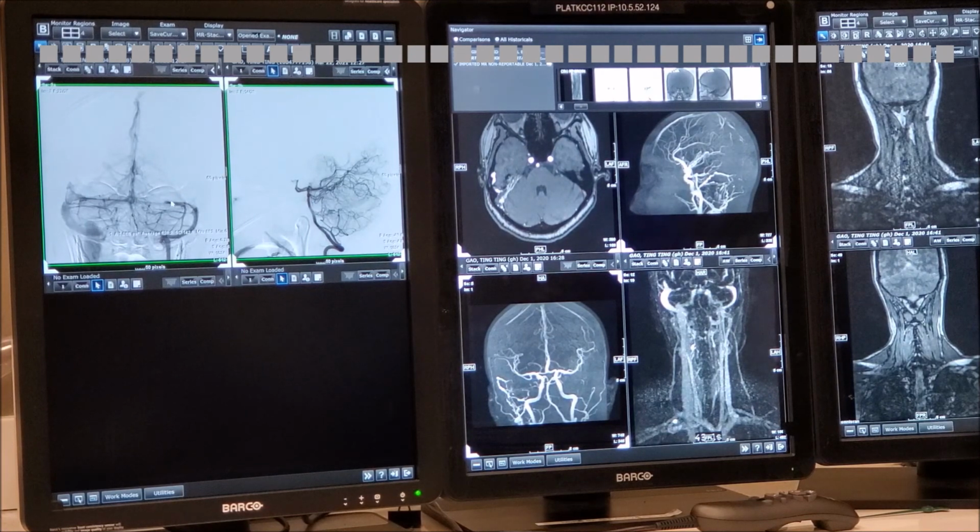Here I'm happier because I see the density of the contrast much less diluted, and the size corresponds to what we're seeing. Plus we're seeing a very prominent cortical vein of the cerebellum coming here. So my estimate is that this is probably developmental, the way the patient was built. This is as much as we can take out from the vert injection.